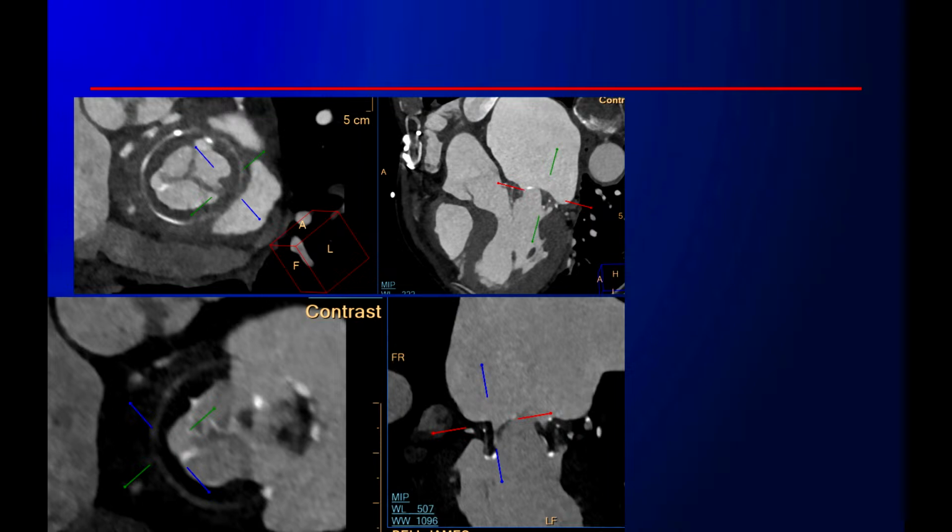Okay, we talk about the degenerative changes, and what else do we see? Pannus, right? There's some low attenuation tissue. This is very abnormal. The Hounsfield unit is about 140, so that's most likely pannus. And Dr. Little asked last week, and I don't have the answer for it, where is the pannus mostly located? If you look at it, it's not that easy to tell. I pay a lot of attention.